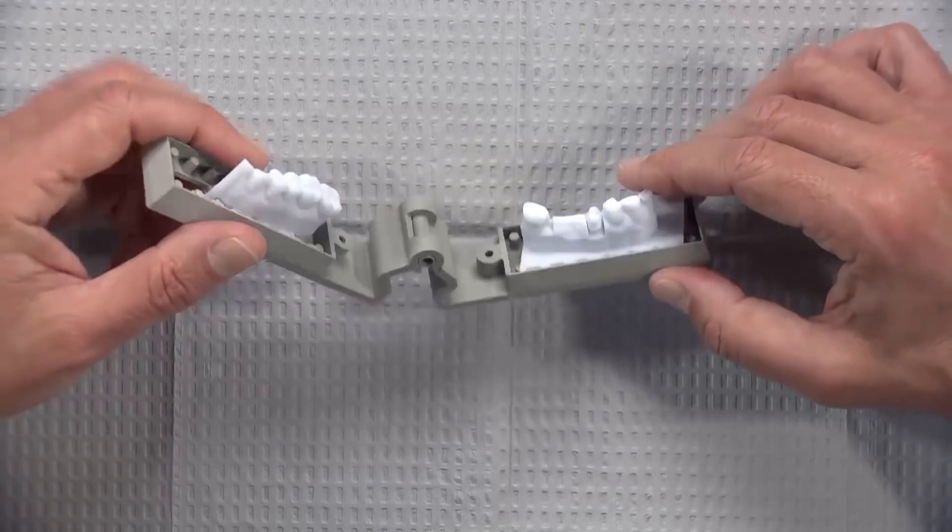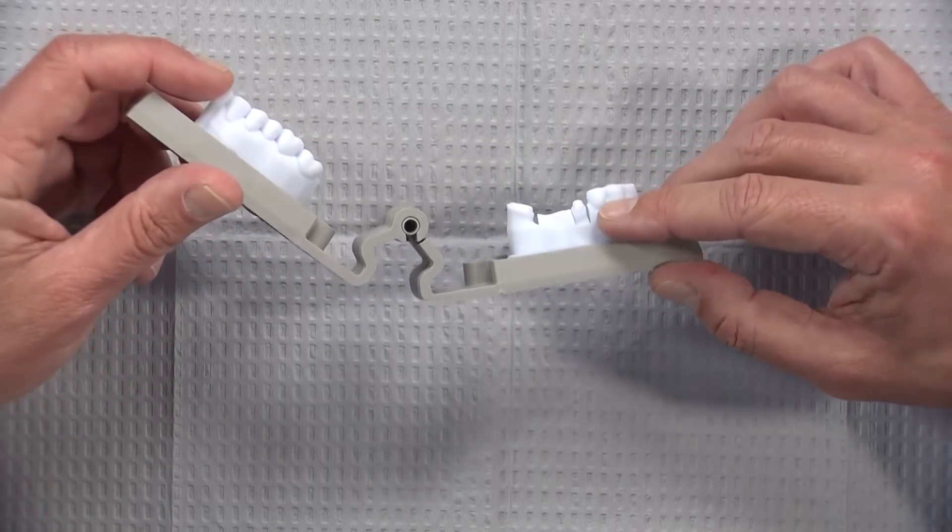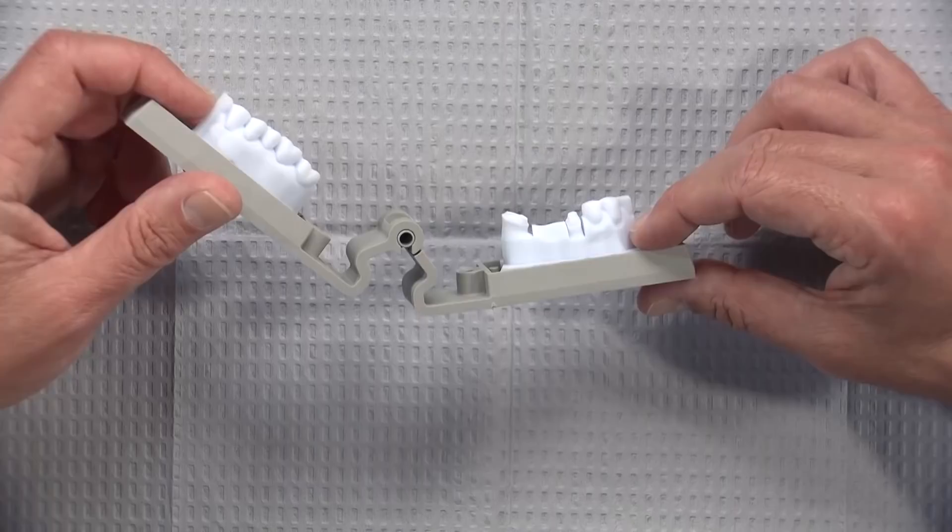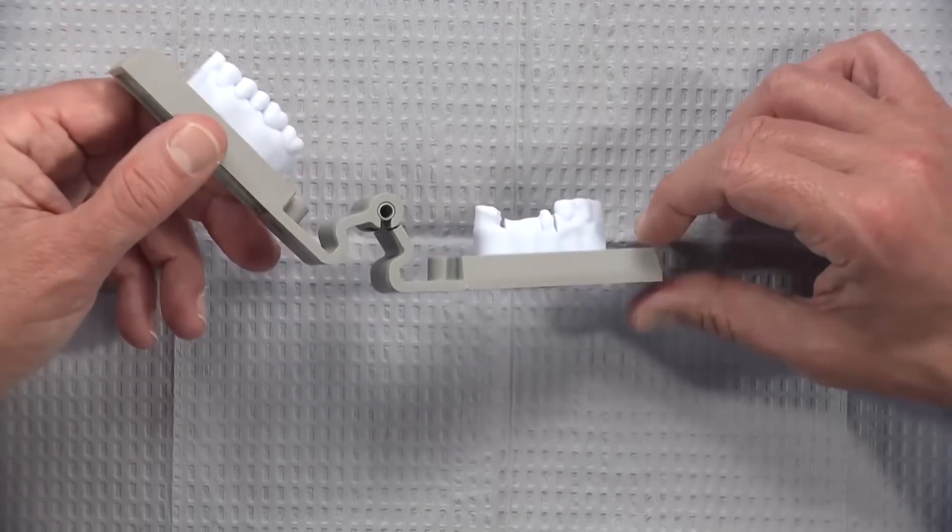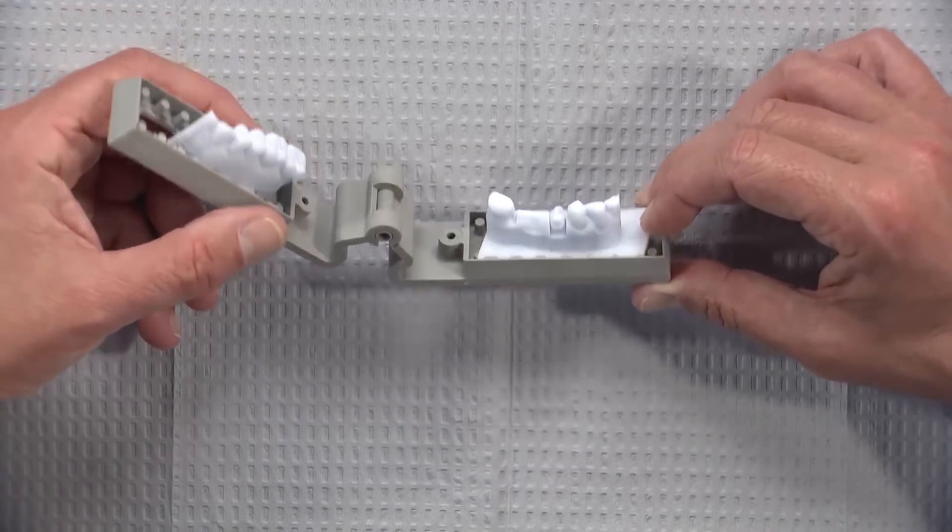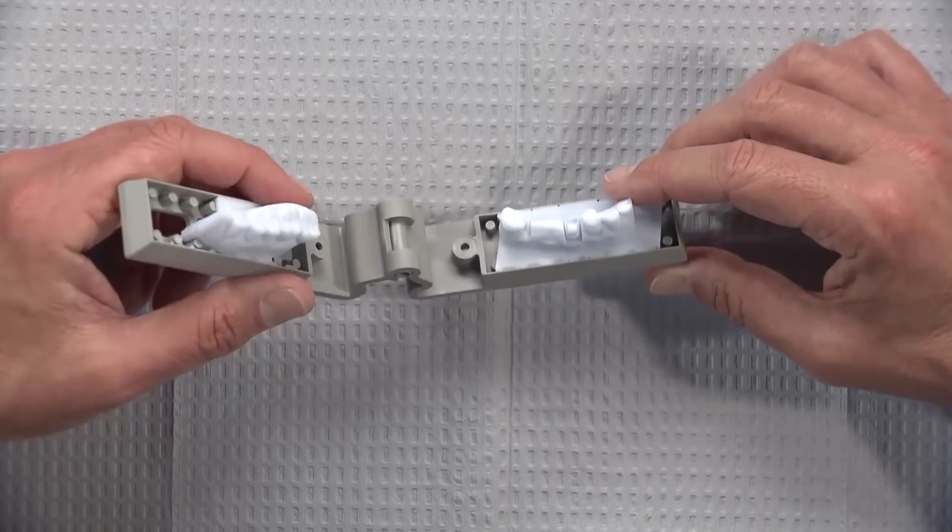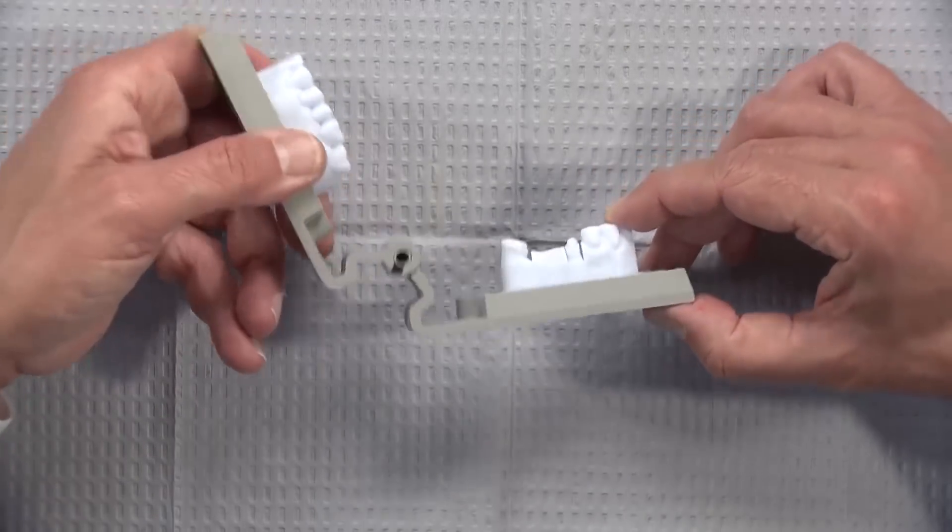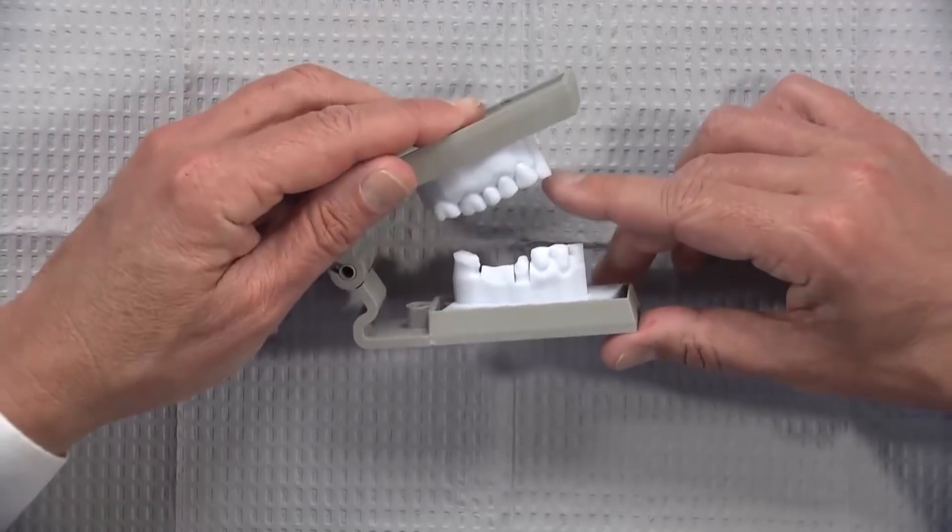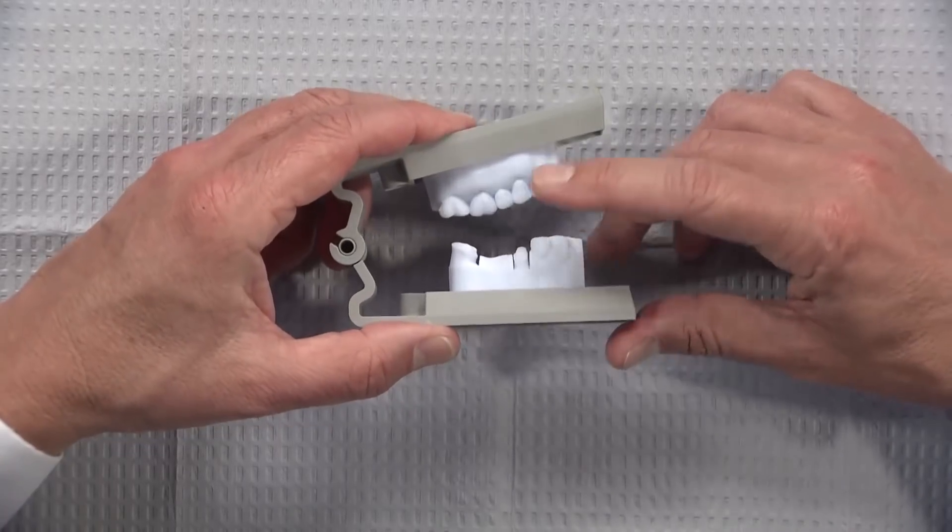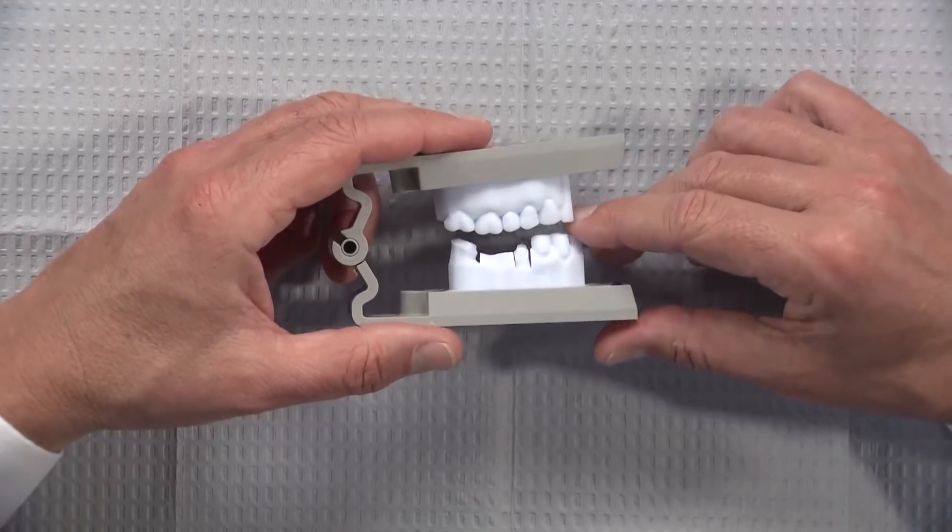If you've seen the way that we fabricate e.max crowns currently, we will use a 3D printer to print a full contour crown, invest it, burn it out, and then press e.max into it. This is the way Sirona makes their models through Infinident, the same way 3D printing.